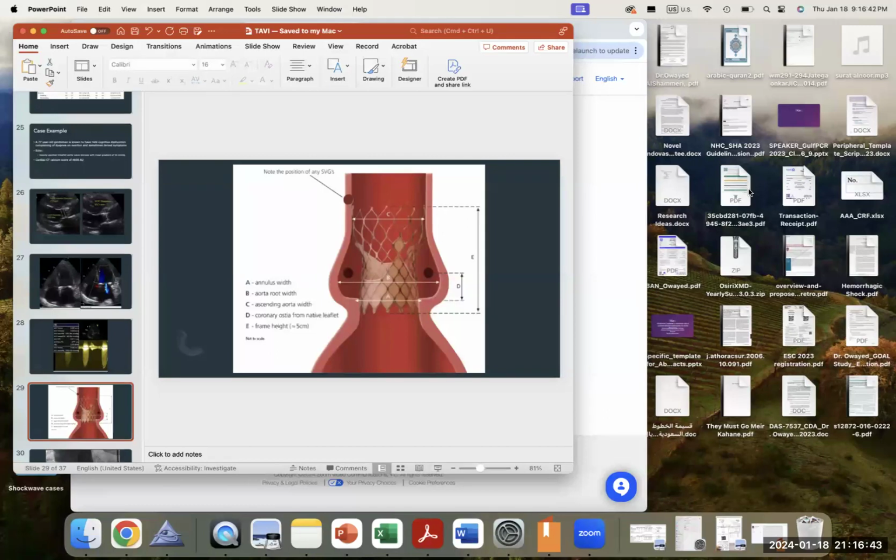With endocarditis, you cannot put the prosthesis in a septic environment. So this is the one case of TAVI with no surgery option, and the one of surgery with no TAVI option, the scenarios that I know.